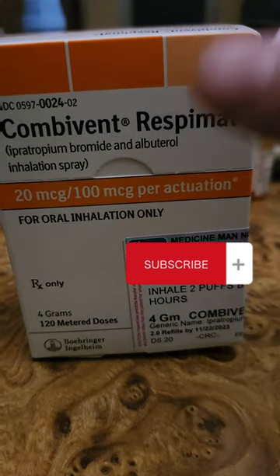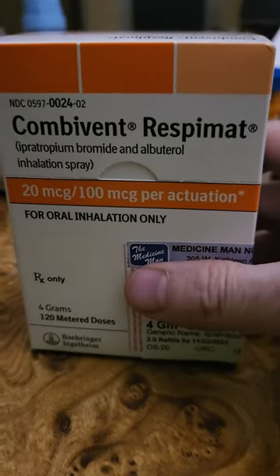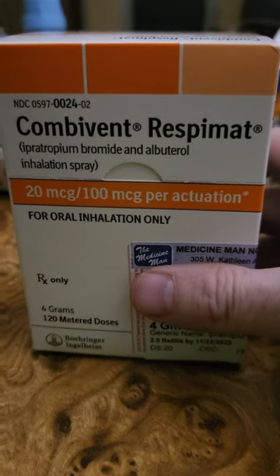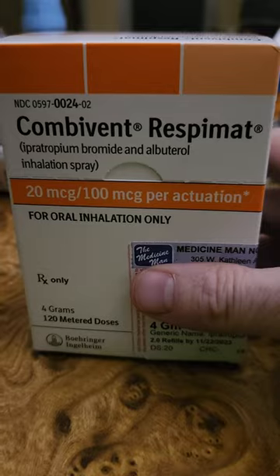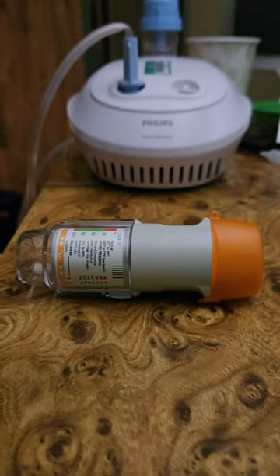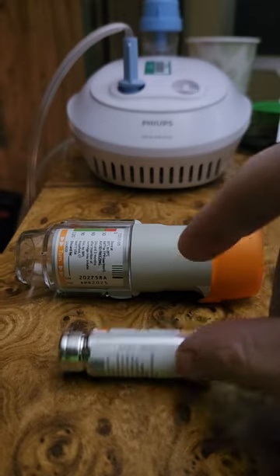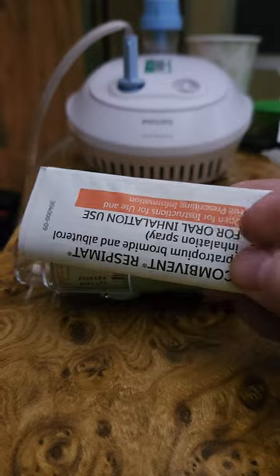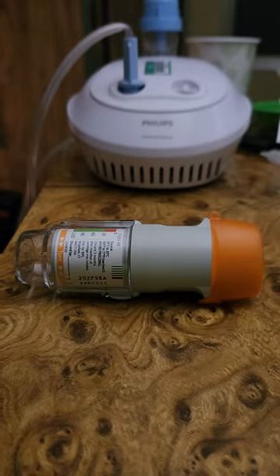Hello friends, I just wanted to make a quick video about the Combivent Respimat inhaler and how it's used. When you open the package, you'll get your inhaler, you get the canister, and then you'll get your information.